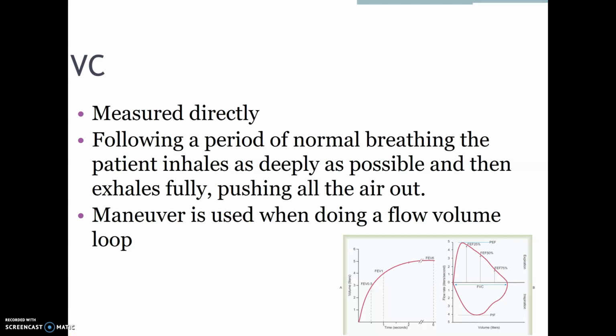So let me switch pen colors here and do that again. For a vital capacity, we have the patient take a deep breath in and then blow all their air out, keep going, keep going, and then another deep breath in.